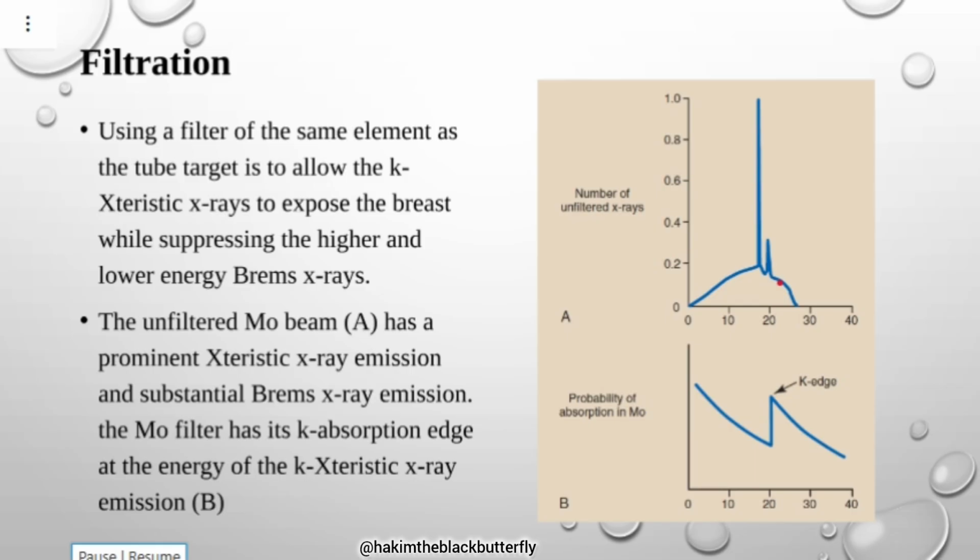Yes, I wanted to know something about compression. Yes. Now we are dealing with a breast which could be having a problem, and you want to find out that problem. And here you are telling us about compressing it. Now, assuming there is a mass which is painful inside that breast, how do you accommodate it? Because compressing it again would bring more pain to the patient. I'm just trying to understand.